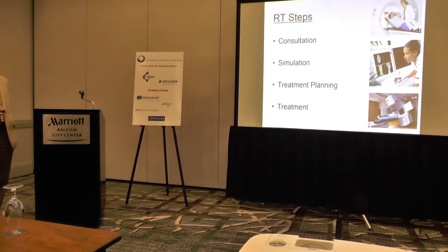All right, so let's talk about therapeutic radiation. Okay, so you get referred to see a radiation oncologist. So this is how it works. The first day you come is you just meet the radiation oncologist who will evaluate you, look at your skin, talk to the other doctors, and make a plan. The next step is simulation. Now, for most skin lymphomas, the simulation is usually pretty simple. We just often have to draw out where on the skin we're going to treat with radiation therapy. But it can be more complex.